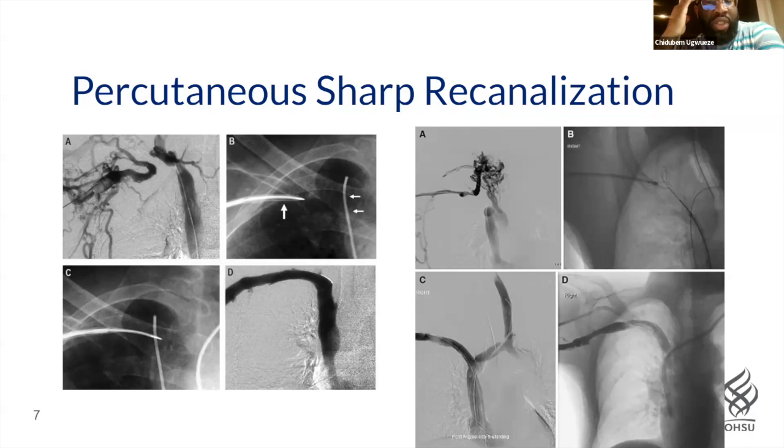Another big consideration that I alluded to earlier is that you have to make sure you're not going across the pericardial reflection. The pericardial reflection is usually just at the level of the carina. So if your area of stenosis is close to or around the pericardial reflection, honestly, I wouldn't feel comfortable doing it at all, because you can get through into the pericardium and cause a pericardial tamponade and death of that patient.